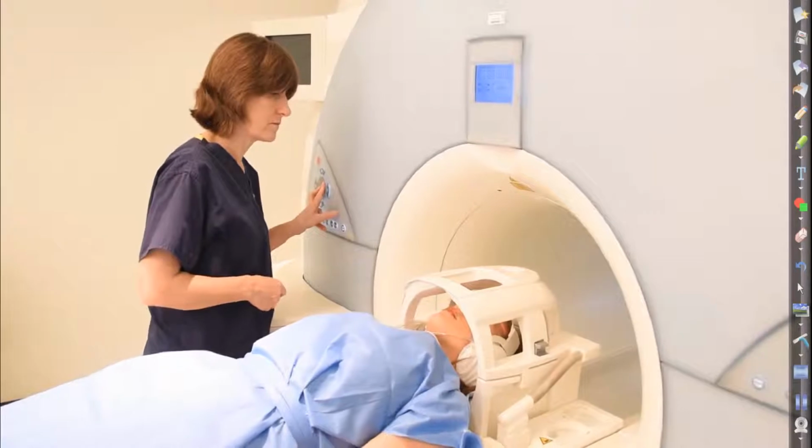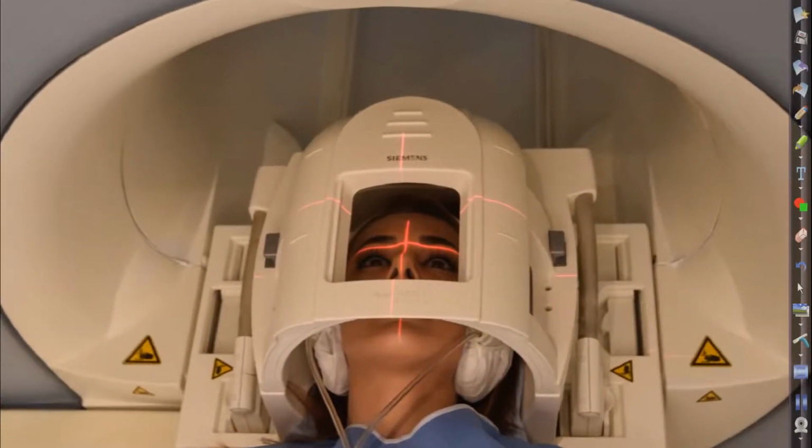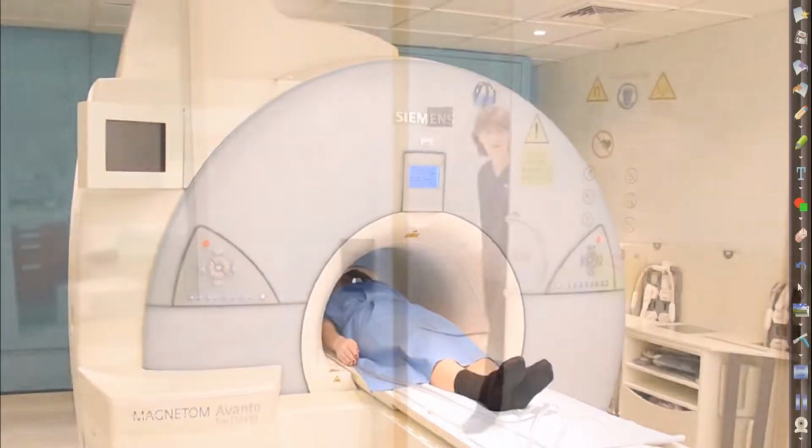Center to the glabella. And move the patient carefully into the scanner. Make sure they're calm and comfortable before you leave the room.